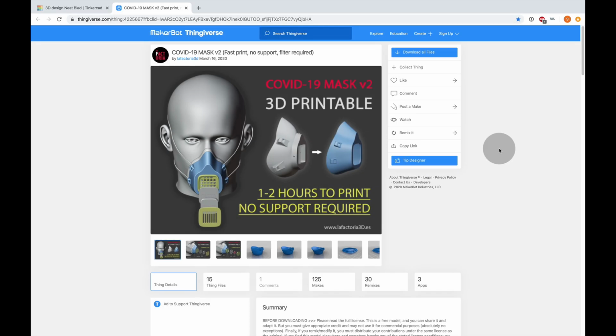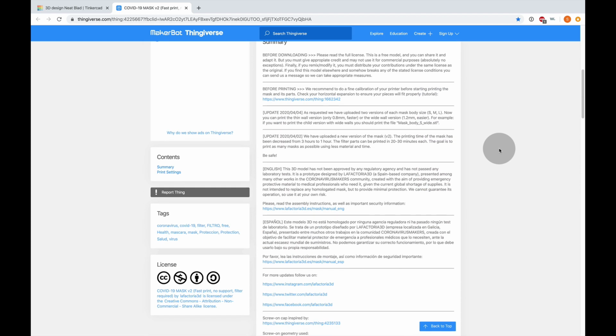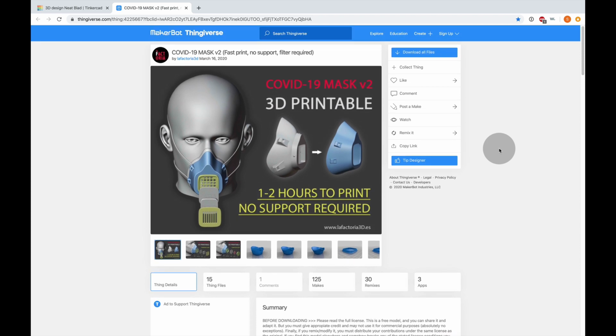The first thing that we got to do is get the 3D printed STL file. Now we're going to get onto Thingiverse, and we are going to get a file from there. I chose this file because a friend of mine recommended this company, and they've been working on different versions of 3D printed face masks for us to print out. But because of the urgency of the situation, I've decided to go with this file instead of designing my own. So here it is.